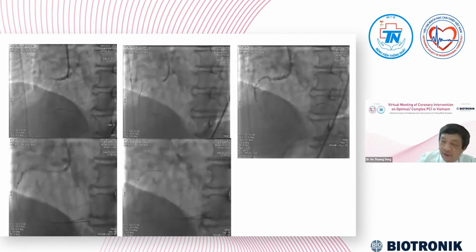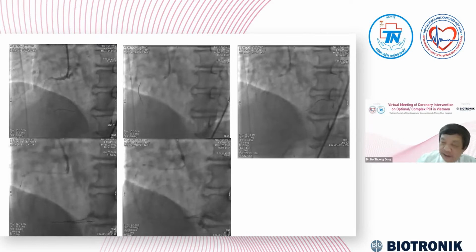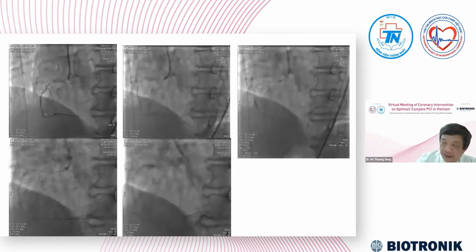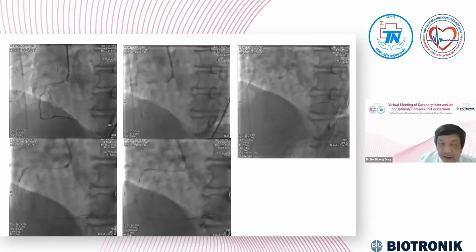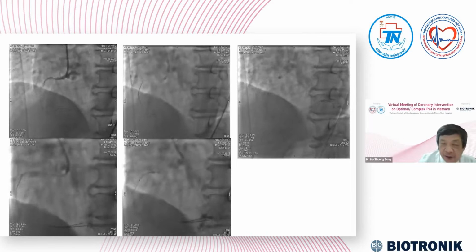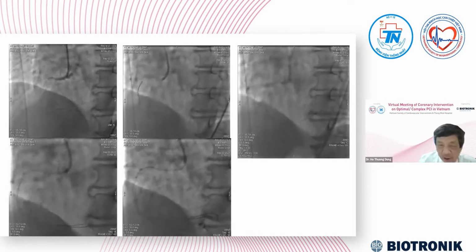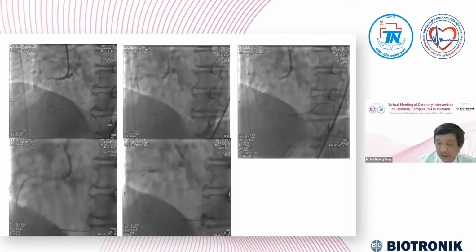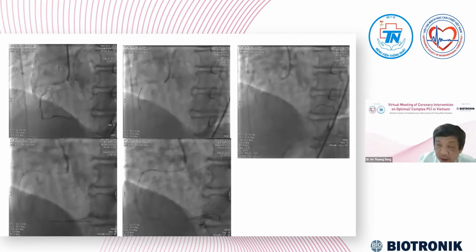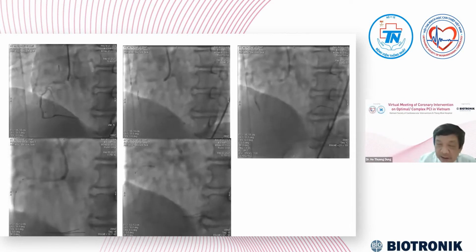Often when we do many stents, the order of stenting is the distal stent first, and after that the proximal stent. In that case, I saw the diameters of the proximal, the mid and the distal RCA were very different. So we made the decision to stent the proximal segment first, to prepare the way for the second stent to go.